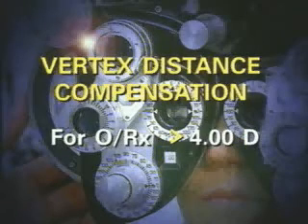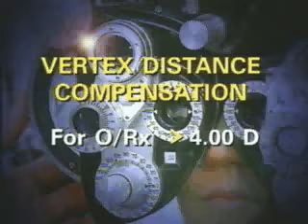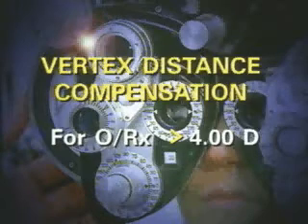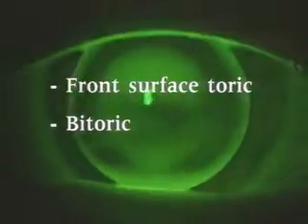If the over-refraction is greater than plus or minus 4 diopters, the vertex distance must be taken into account when calculating the final lens back vertex power. If the vision is not corrected adequately by a spherical lens, it is possible to order a front surface toric or a bitoric lens design. In most cases, it is best to order a spherical lens and reassess the visual performance at the first aftercare visit.